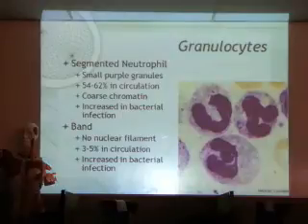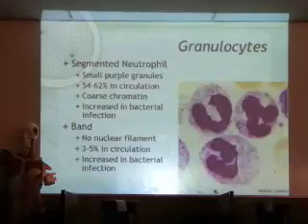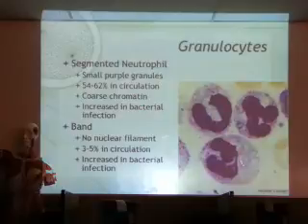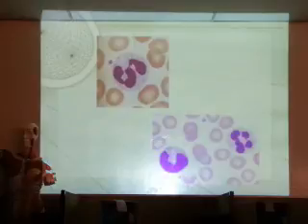And you see an increase in this particular cell line, especially an increase in band count, associated with bacterial infection. Bacterial infection. Okay. So next time, these two are called bands. And this one is closer to a segmented form, but strictly speaking, this is not a segmented neutrophil just yet, because this line here is just a little bit too thick. Here, you can see this filament is a lot thinner, yeah? More thread-like. This one is pretty thin.